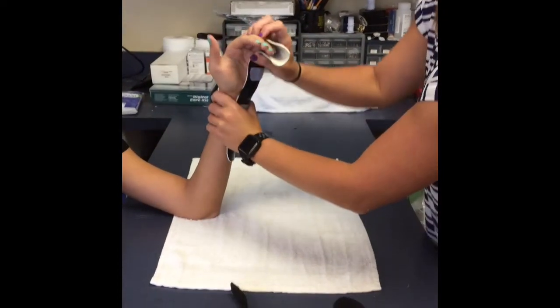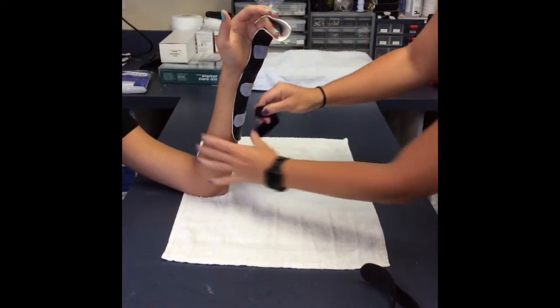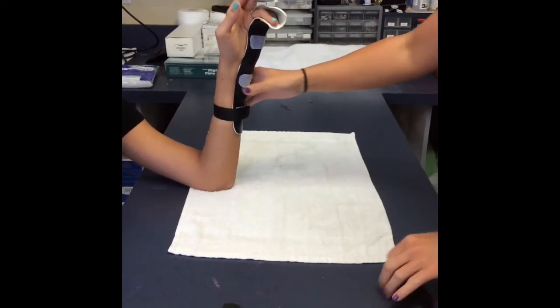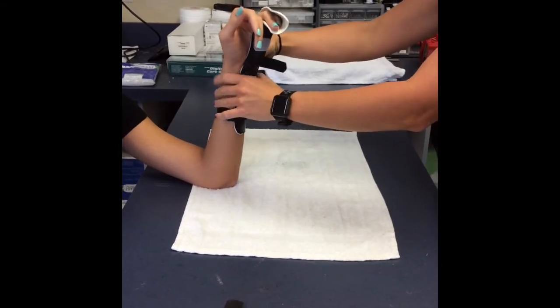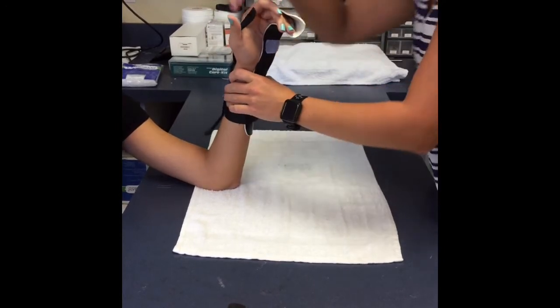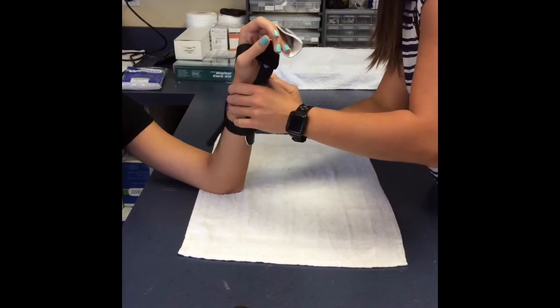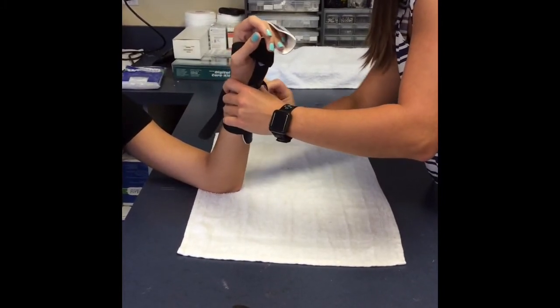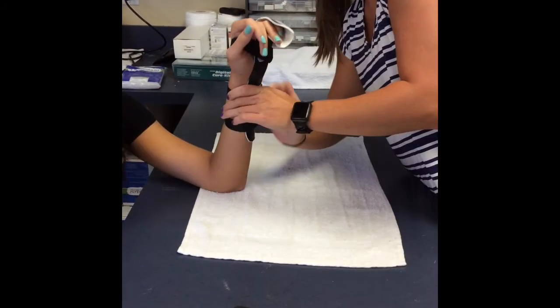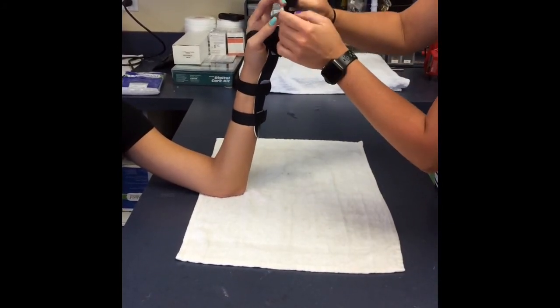Strap your patient into the orthosis to make sure it fits correctly using the soft straps. As you can see, one of my straps goes through the patient's web space, and this strap you can make more thin so the edges of the strap don't irritate the patient when he or she is moving the thumb. The last strap should secure the ring finger and the small finger. You could use two straps here if needed.